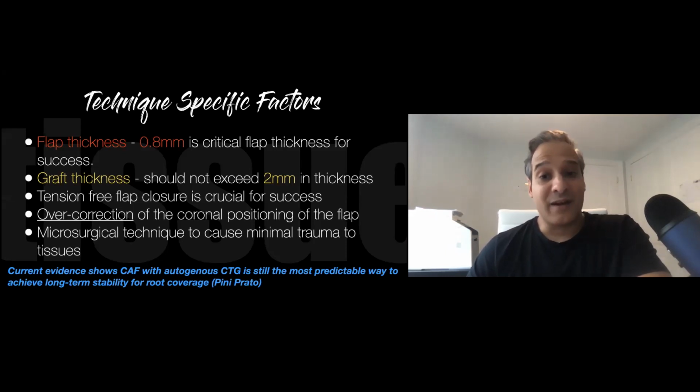The thickness of the graft, you don't want to have a graft that's too thick, because remember, once it gets transplanted, the graft has to regain its vascularity, it has to get its blood supply again. So the thicker it is, the harder it is to get much blood supply, and you end up with a lot of graft shrinkage and necrosis.